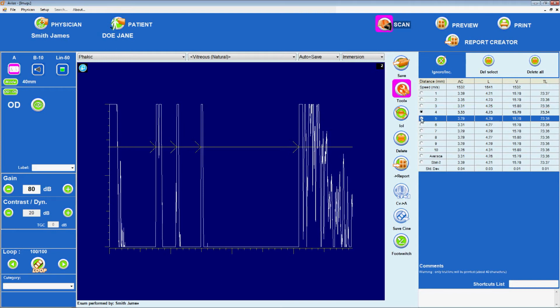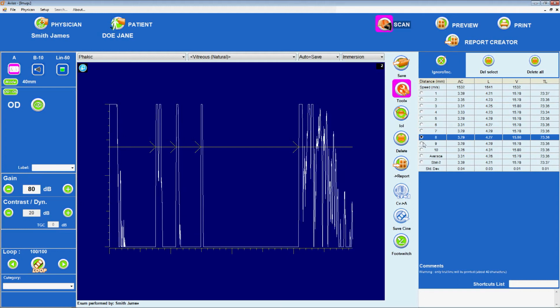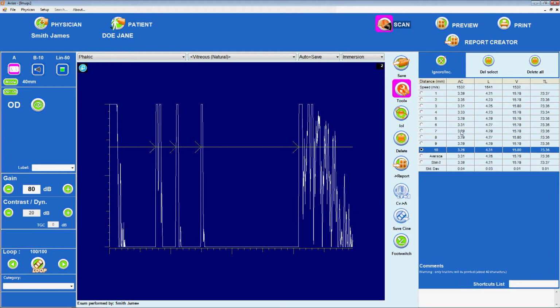Finally, the examiner should select the thickest lens measurement because the lens is generally thickest in its center. Using the highest value for lens thickness helps to ensure that the ultrasound beam was directed nearest to the center of the lens.